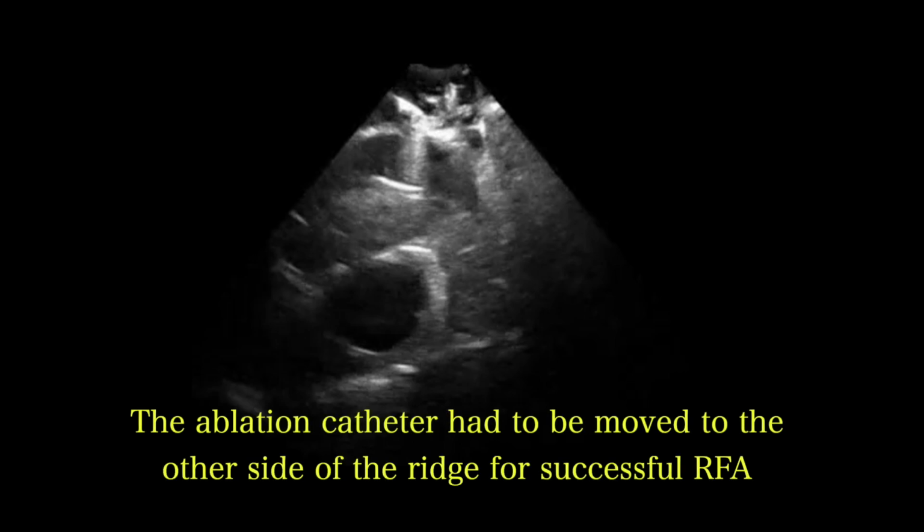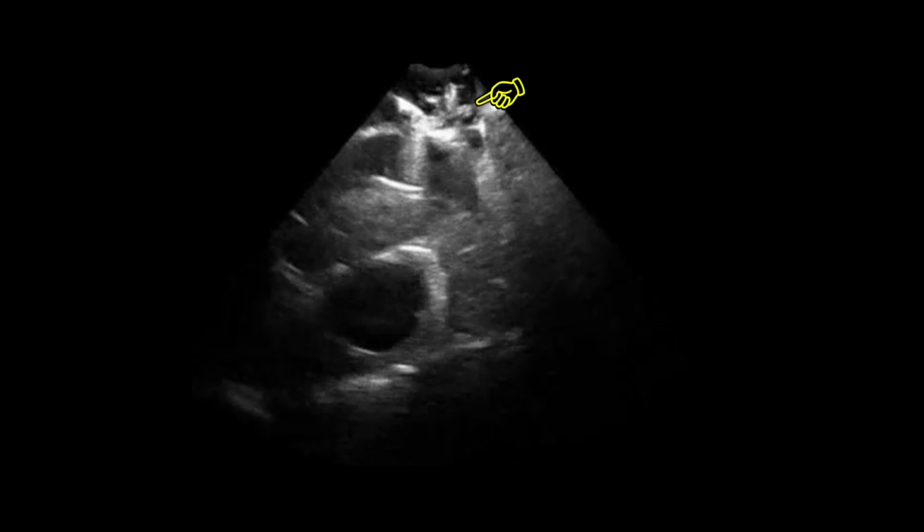Now we are going to talk about atrial tachycardia from the right atrial appendage. Here you can appreciate that is the roof and apex of the right atrial appendage. That's the apex. And when you look at it closely, you can see that is the ablation catheter. And there is a small ridge there, and that ridge was inside the apex. And actually, atrial tachycardia was coming from the other side of the ridge. So since we were able to see it on the ICE, the ablation catheter was moved towards the other side of the ridge, which resulted in successful radiofrequency ablation.